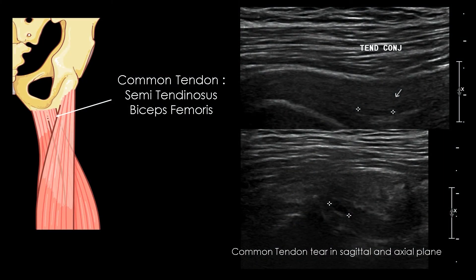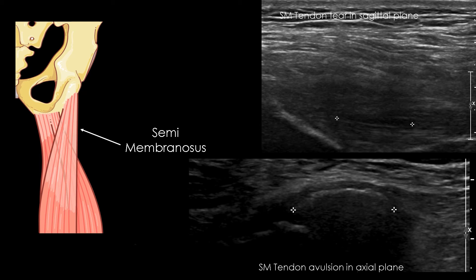The pathologies of the hamstring tendons are generally tendinosis, tendon tear, or tendon avulsion at the ischiatic area. Tendon tear is represented by a fine anechoic lesion in both the sagittal and axial planes, and avulsion of the tendon is generally represented by a displacement of the ischiatic bone in the caudal part of the hamstring. Tendon tear or tendinosis of the common tendon are usually more superficial than the own semi-membranosus tendon.